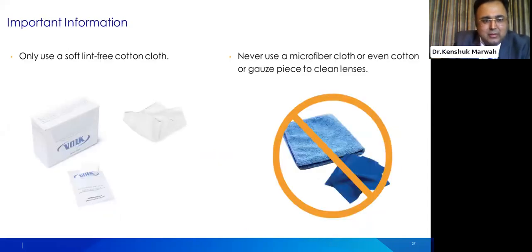This is the lint-free cloth, the Volk cloth which is available. Never use a microfiber cloth, or sometimes gauze pieces are available in the vicinity where we are seeing the patient, and we use a gauze piece. Those are not to be used because they cause scratches on the lens. We should avoid the lint cloth or these gauze pieces to clean our lenses, because these are the primary culprits causing the scratches on our lenses.